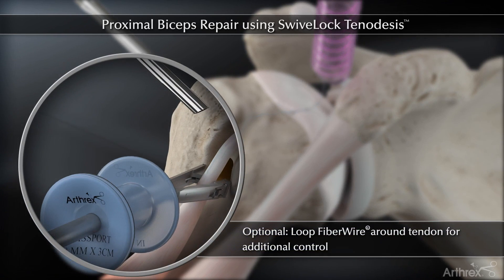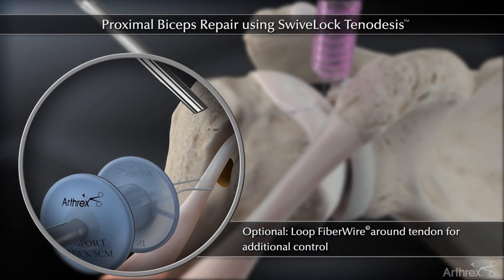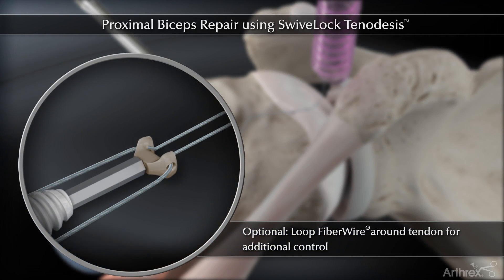If additional control of the tendon is desired, a fiber wire can be passed around the tendon and loaded through the holes in the forked tip.